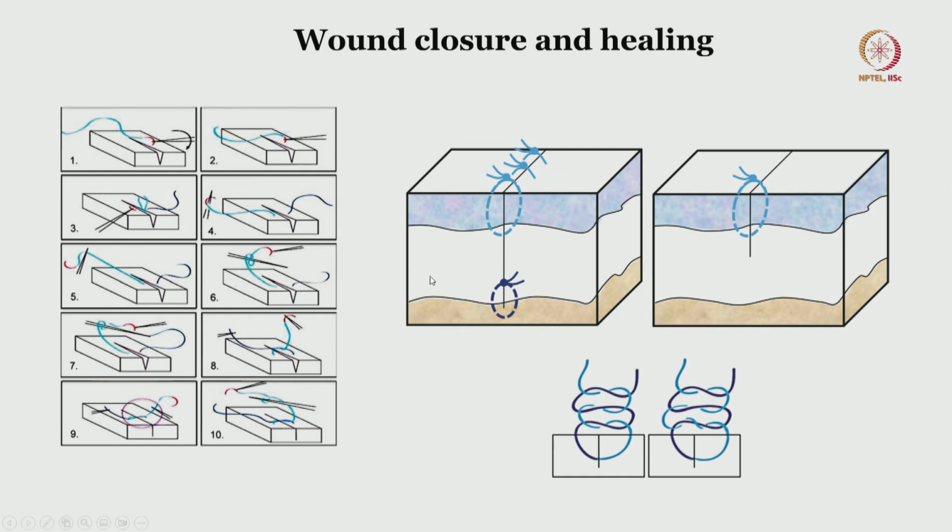You can do the suturing in either 2 layers or 1 layer. For the rat model, generally 1 layer should suffice, because the scalp layer is just 1 layer, beneath which you have muscle only. For the temporal craniotomy, the temporalis muscle is usually excised, so you do not really have to suture it back, as we saw. But if it is the abdomen or the spine, then you will have to close in 2 layers, where the muscular layer forms 1 layer and on top of that the skin comes in. Alright, so these are examples of simple sutures.